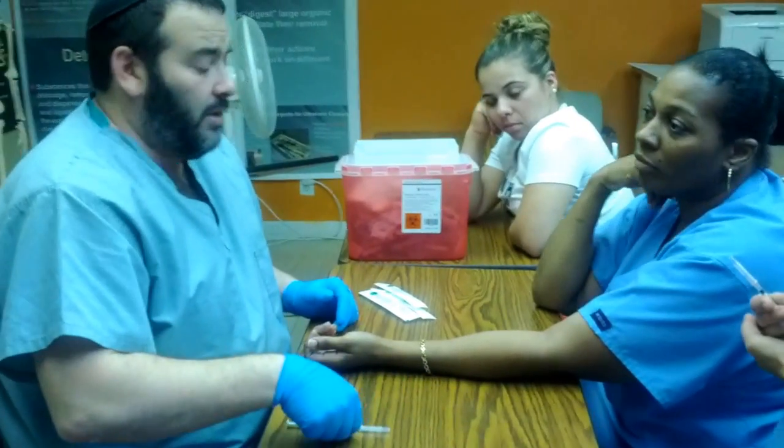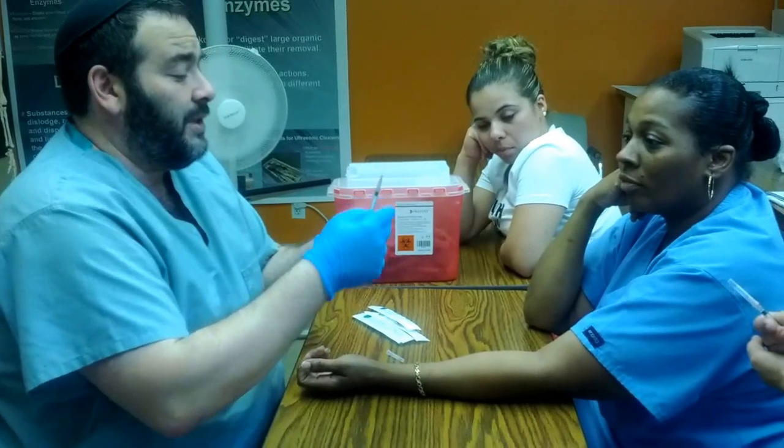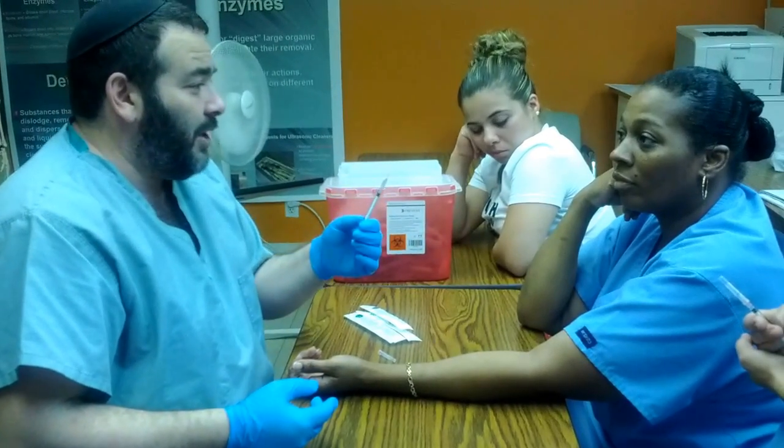It's because the alcohol causes pain, not the actual needle. If you can see this needle at all, you can see that it's tiny — it can't possibly hurt anyone.